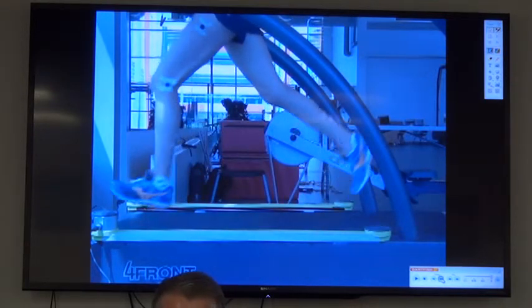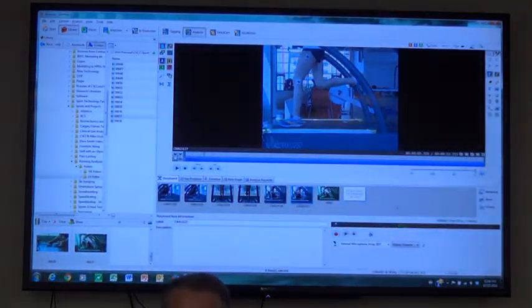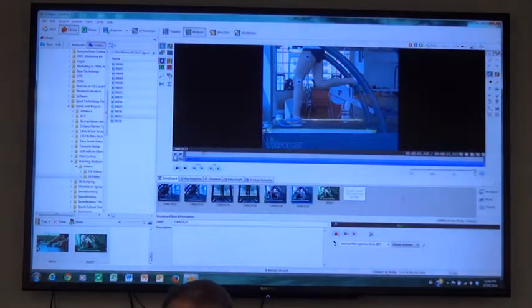Okay, so our task right now is to do an assessment of this with and without her orthotics. The condition that I pulled all the videos for is with her orthotics, and the first videos are without her orthotics. So let's do some assessments, and I'll show you what I would do.